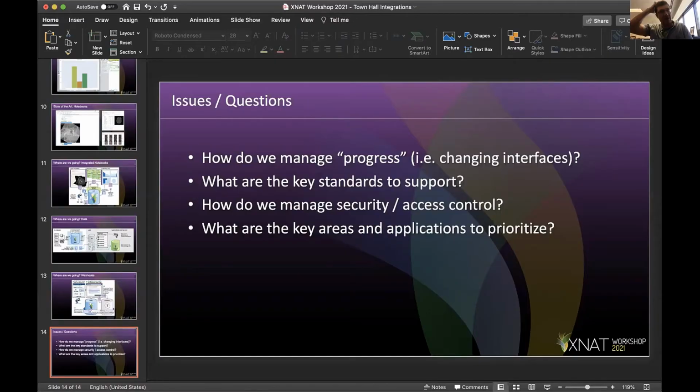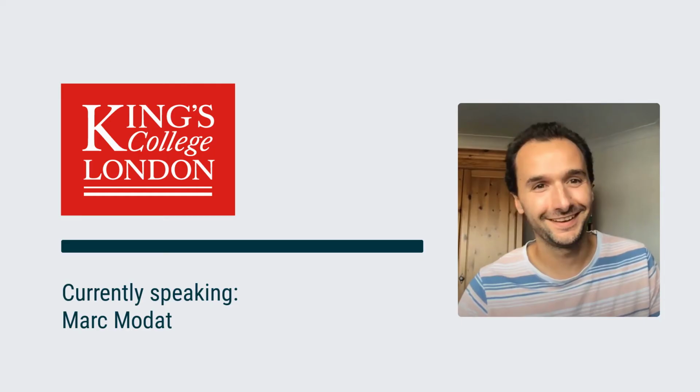Yeah, well, on the first pass, we're really using this just to identify the patient cohorts based on the clinical filtering, and then pulling the relevant exams. So it's not actually storing the clinical data. You're using that as inclusion and exclusion criteria and then focusing on the imaging only.